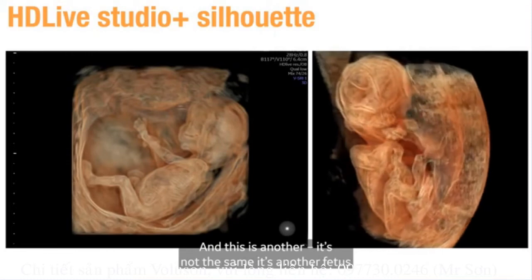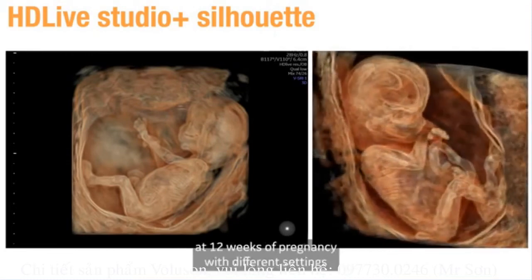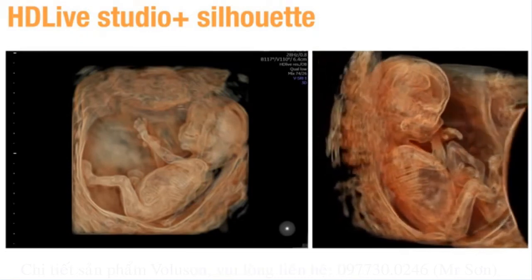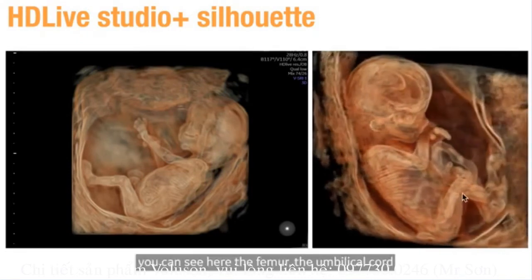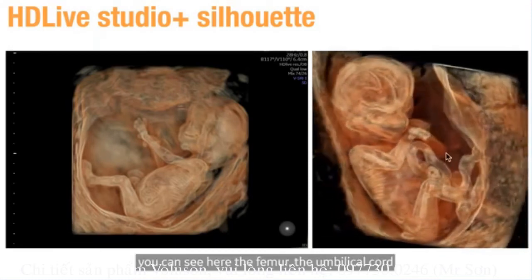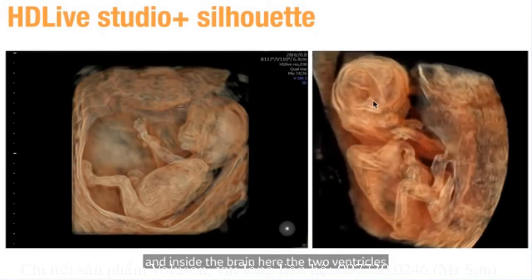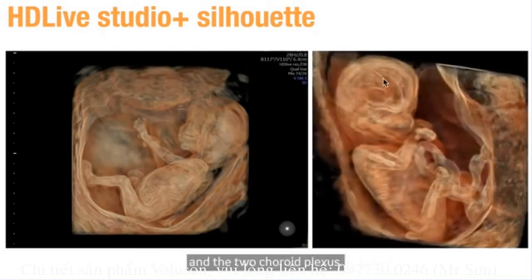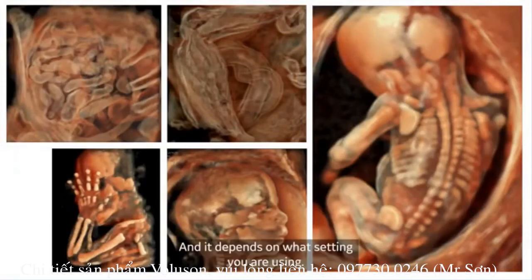And this is another, it's not the same, it's another fetus at 12 weeks of pregnancy with different settings, where also you can see the ribs inside, you can see here the femur, the umbilical cord, and inside the brain here the 2 ventricles and the 2 choroid plexus. And it depends on what setting you are using.